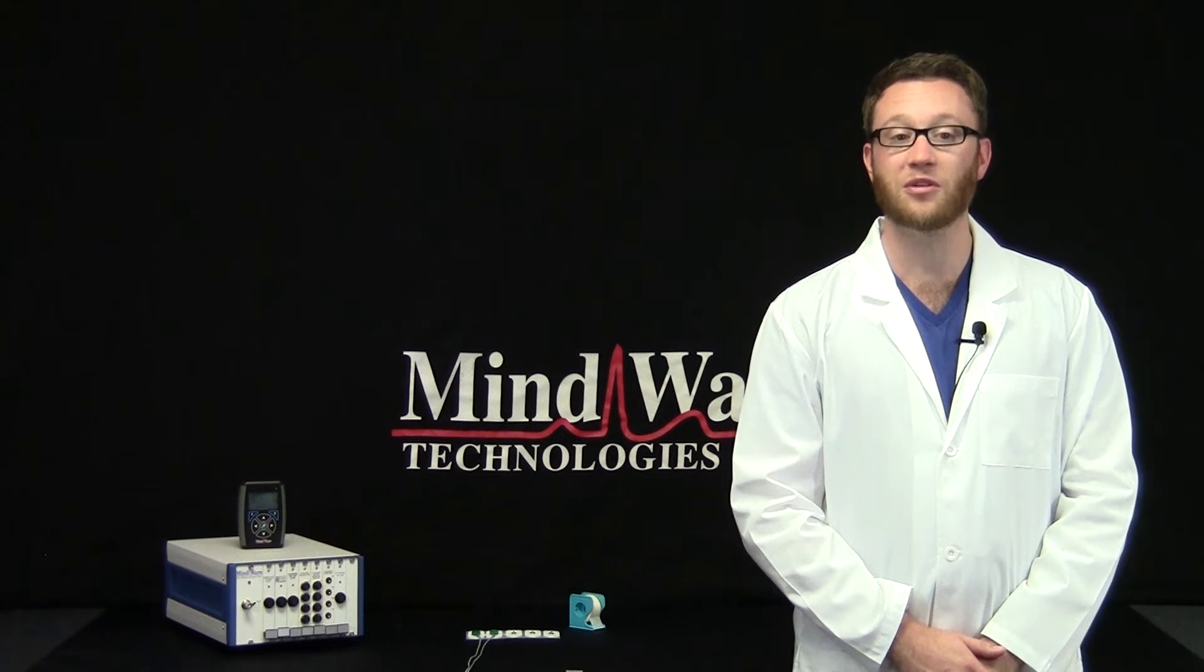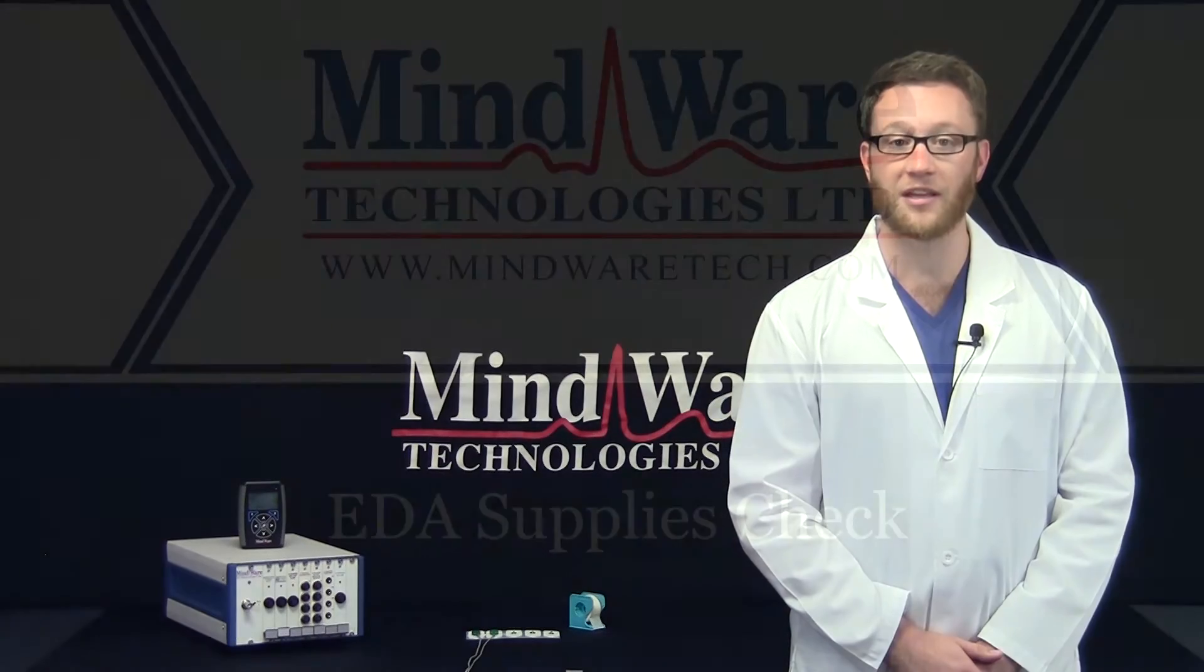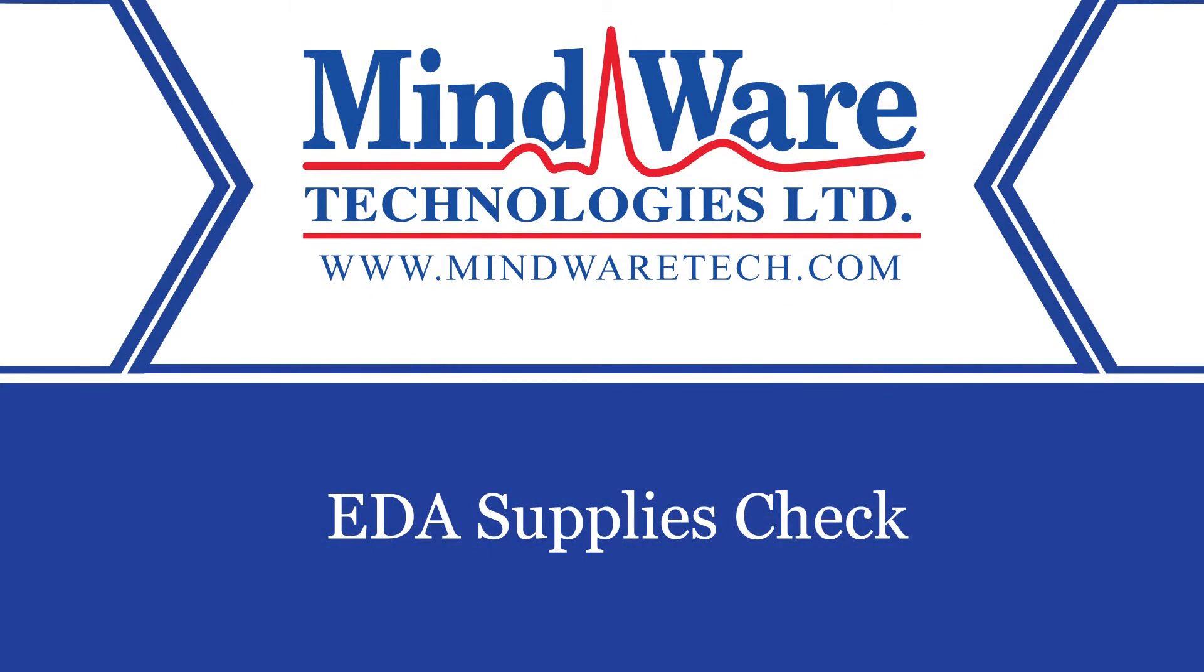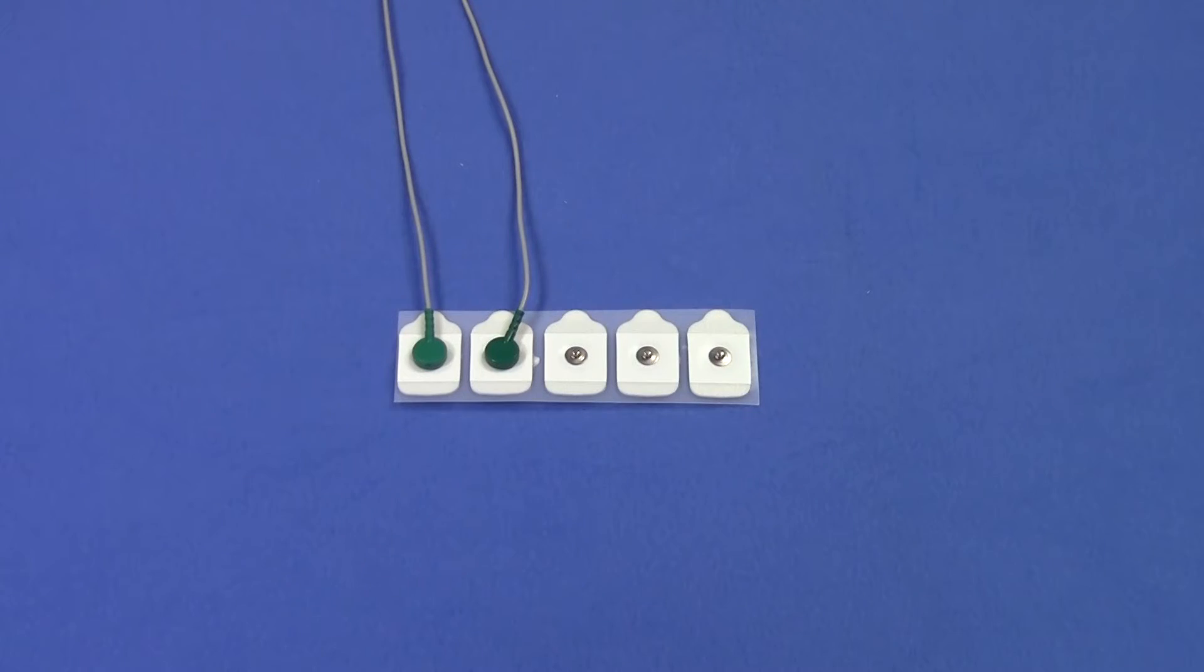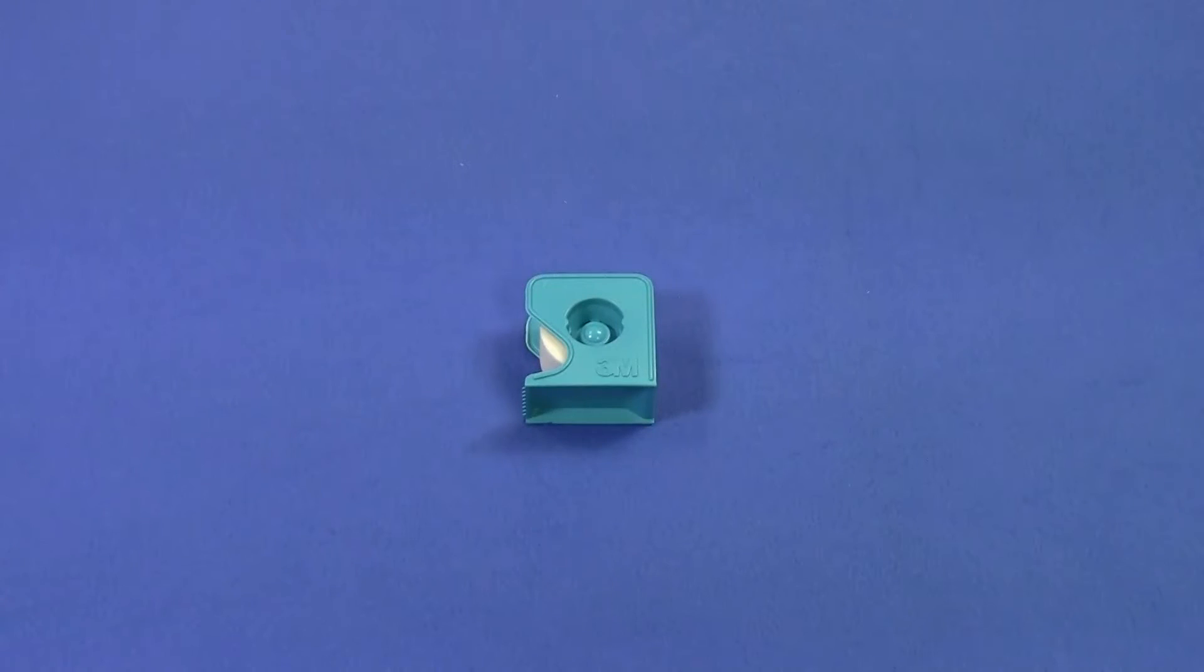First, let's take inventory of the necessary supplies for collecting EDA. To collect EDA, we need two GSC medical sensors or electrodes with two lead wires attached and micropore tape.